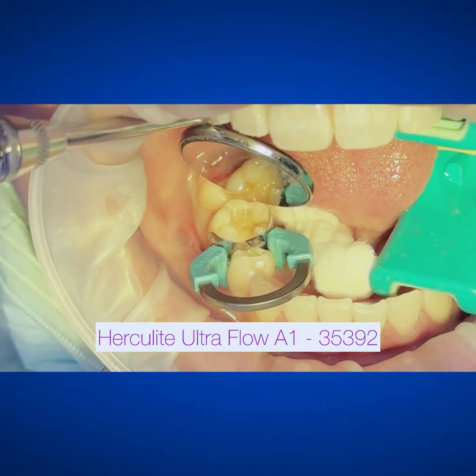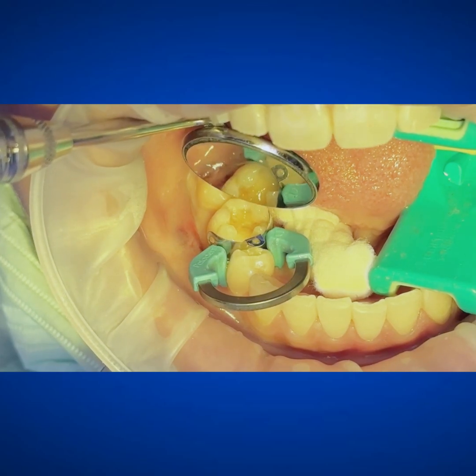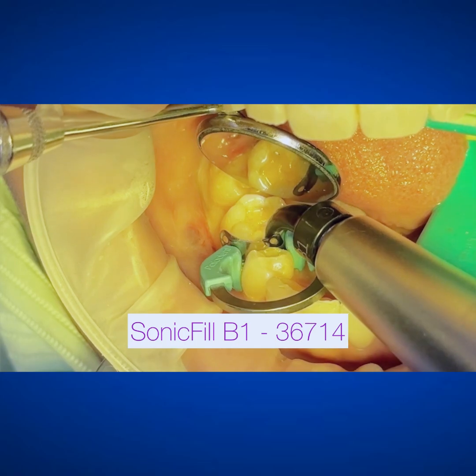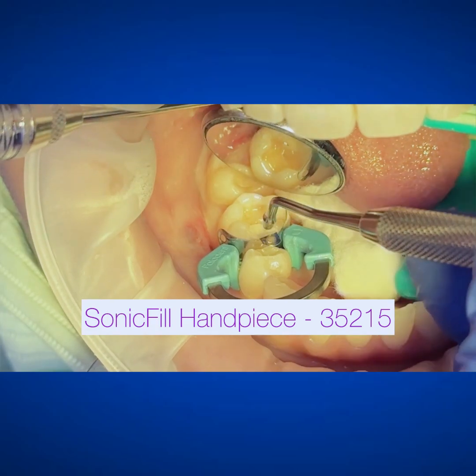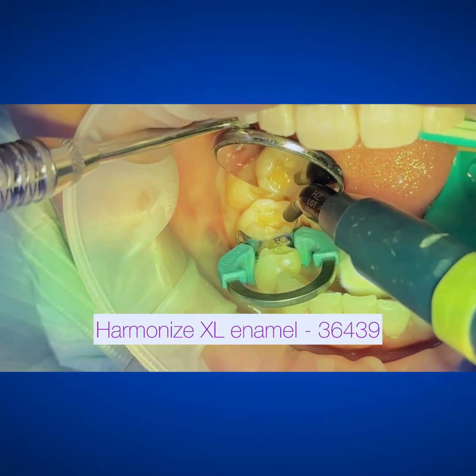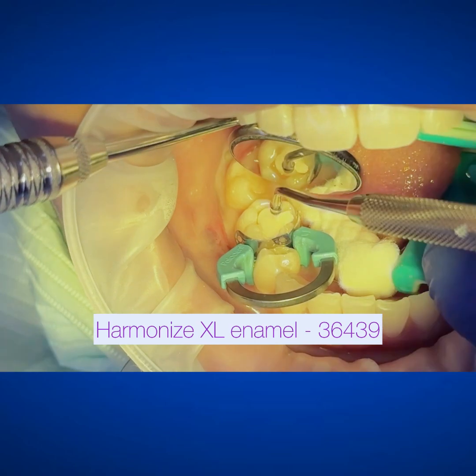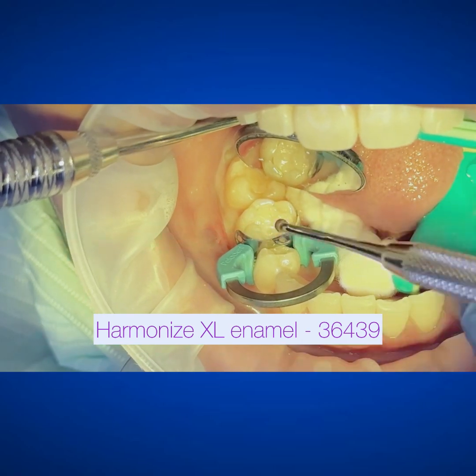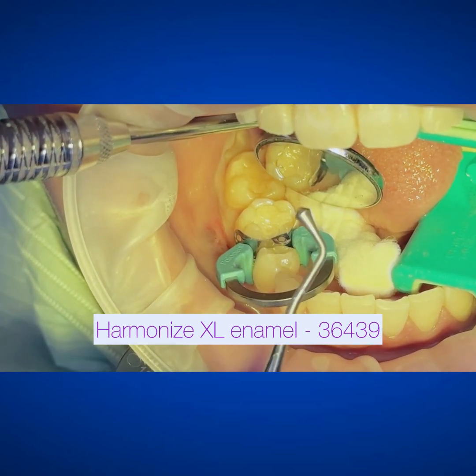Here's my flow that I like to use. It's called Herculite Ultra Flow. I'll use an A1 to line the box, typically. It's got a great viscosity, it moves well, and it also blocks out color pretty well, so it's very useful for these things. Then I'll get in there with the Sonic Fill — I use the B1 here, I really like how it looks. I'll do a large bulk fill, and then just for the grand finale, I like to go over it with the Harmonize because it works really well in my hands. It shapes amazingly, I can condense it super well, it gets an amazing gloss, and the color is fantastic.